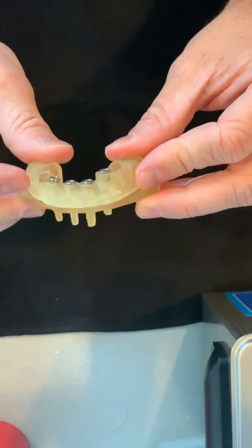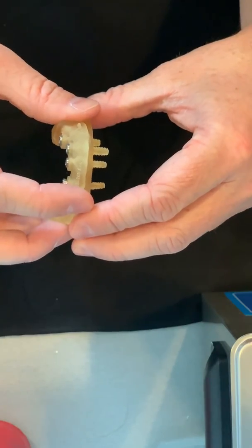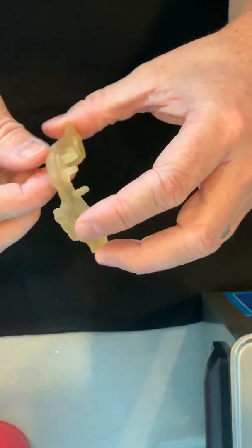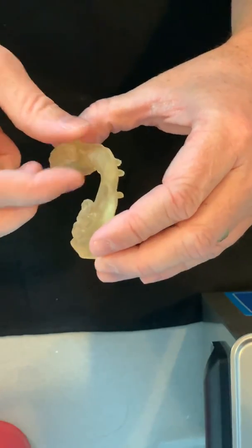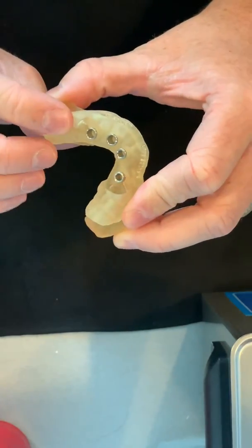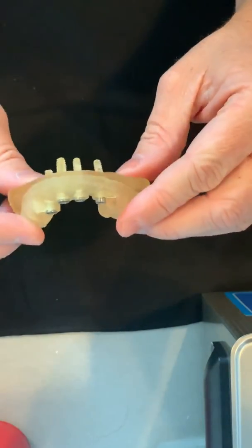That minimizes the time it takes to place these because everything is planned up front, and it also makes things more accurate in the long run. So hopefully that explains how we place implants and do it better, more accurately, and faster than we did in the past.